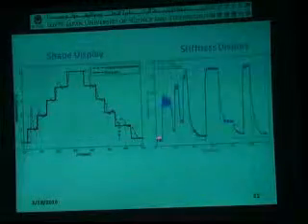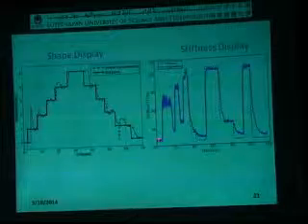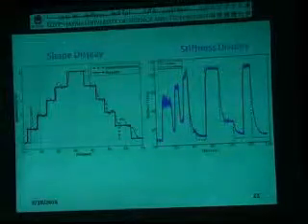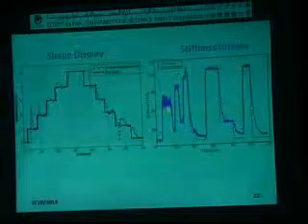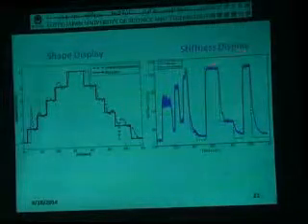And also you can ask this device to display any stiffness. For example, here is 35 to 100. So you can display X and 3X stiffness. Our work is published in a journal, about a multimodal tactile display device, because we display shape and stiffness, so it's multimodal.